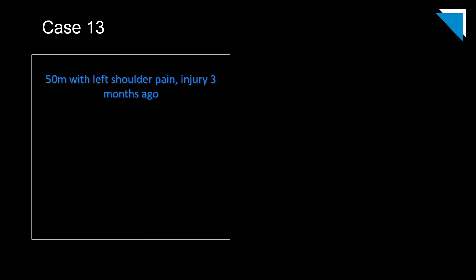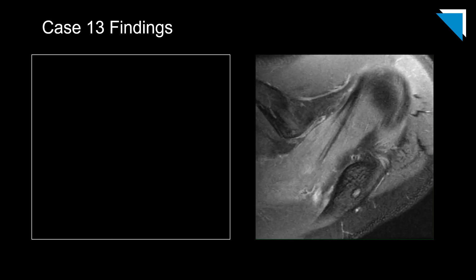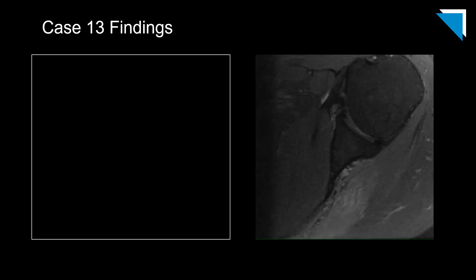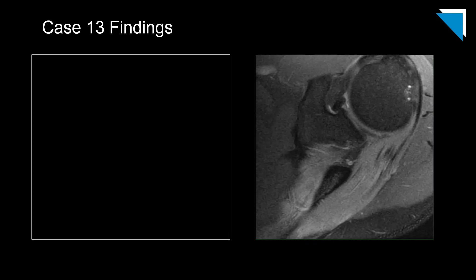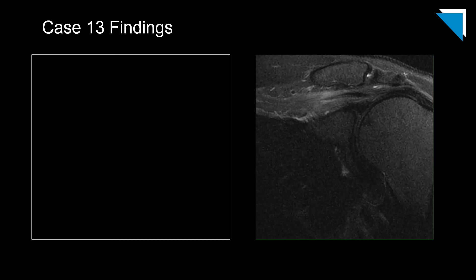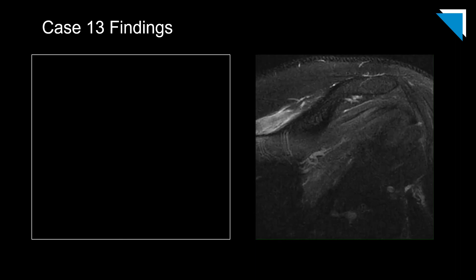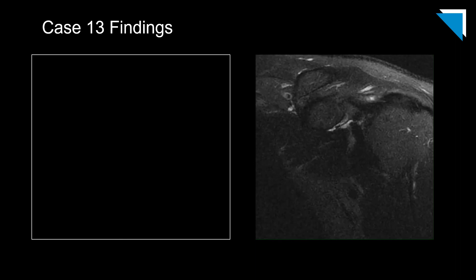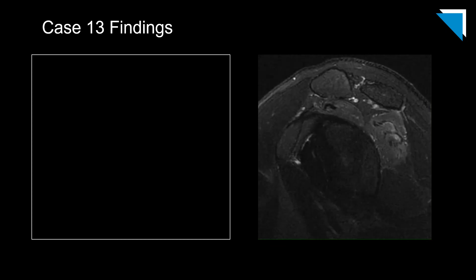Let's take a look at one more case: a 50-year-old man with left shoulder pain and an injury three months ago. These are axial fat-suppressed fluid-sensitive sequences from an MRI of the shoulder — these sequences are terrific for looking at bone marrow and soft tissue edema. I'll draw your attention to the supraspinatus and infraspinatus muscle bellies. Here are the corresponding coronal images and finally the sagittal sequence, which really demonstrates the findings beautifully.